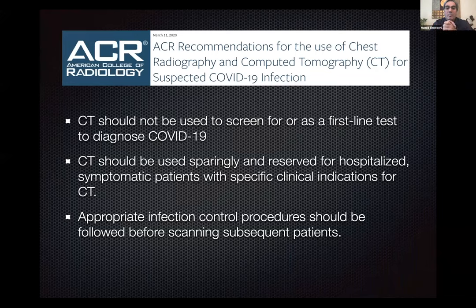This is a pandemic, but we are adopting all these modalities and all different techniques locally. It all depends on the resources, comfort level, and actually prioritizing resources. One idea that is coming up with all this imaging is the actual triaging of resources. In a pandemic and in any disaster, that's one of the most important functions of any kind of imaging that we are using. We are using this to decide which of these patients is going to get an ICU bed. That's not about diagnostics anymore. You are triaging your ICU bed based on the imaging that you are getting.